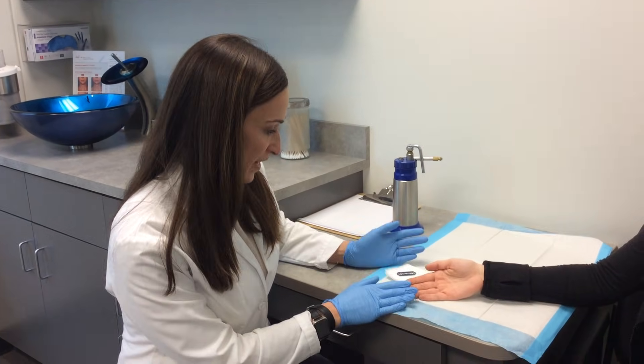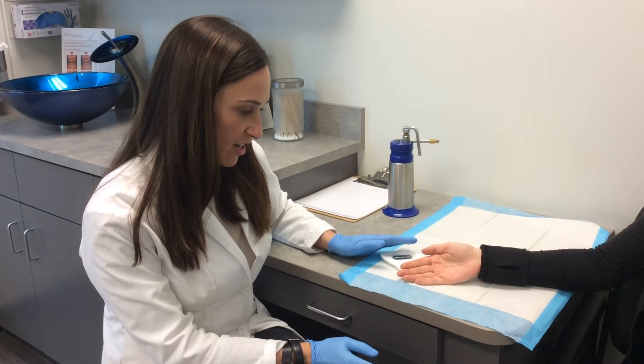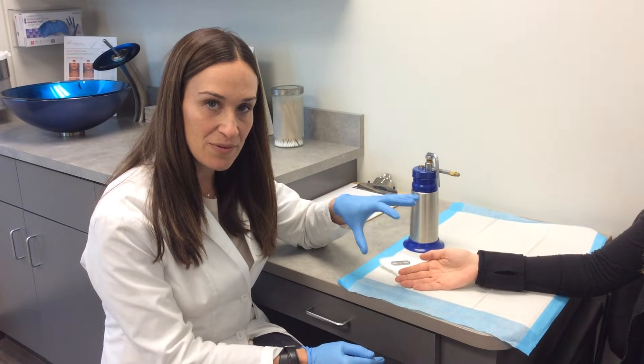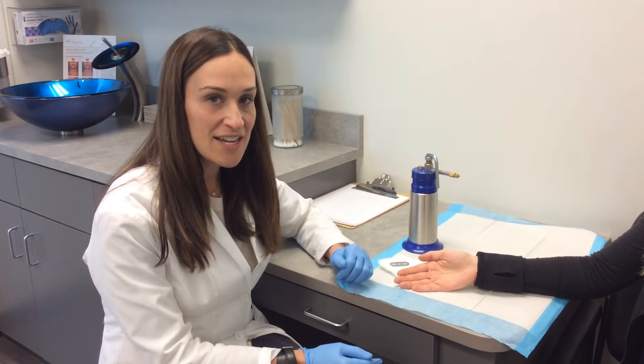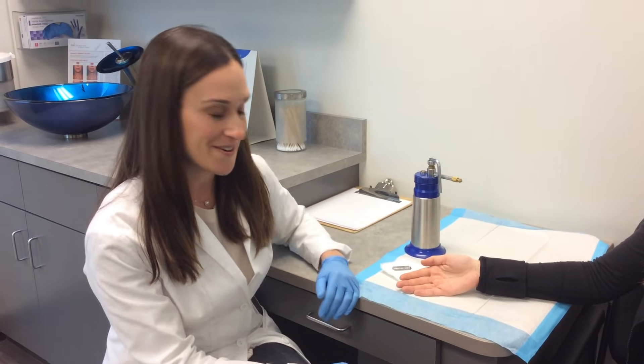Marissa has a wart here on her finger. So the first thing we're going to do is pare it down, which she won't feel at all. Then we're going to use this liquid nitrogen canister to spray liquid nitrogen on the wart, take those viral cells down to a temperature that they can't survive at, and get rid of this wart for her.